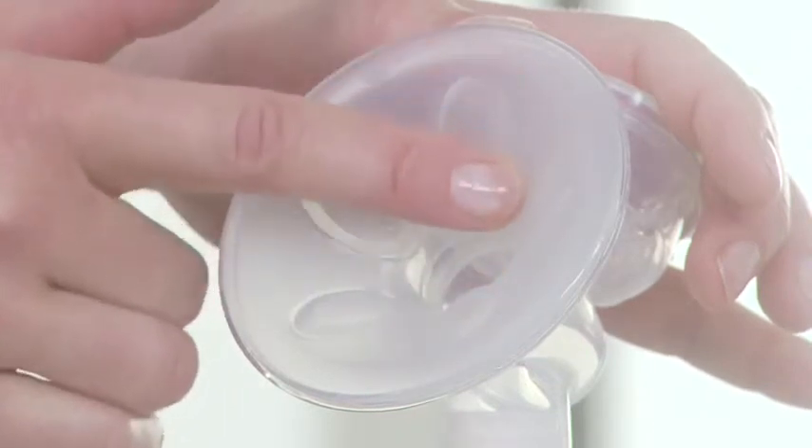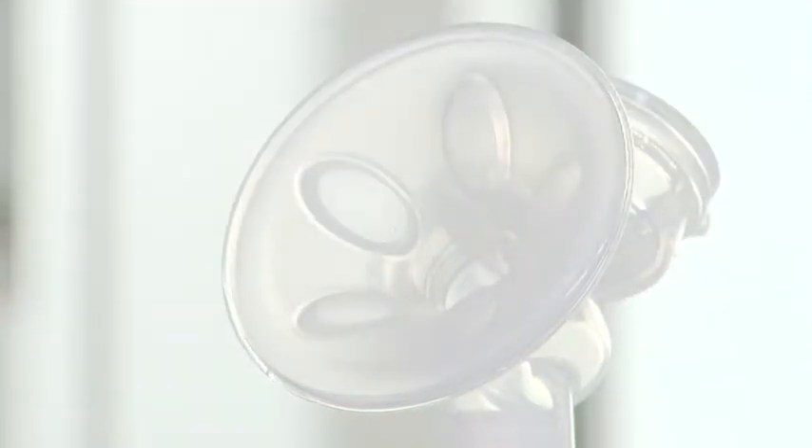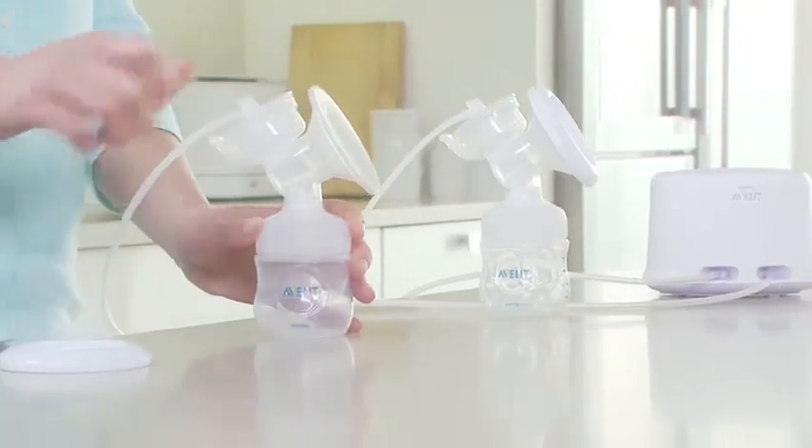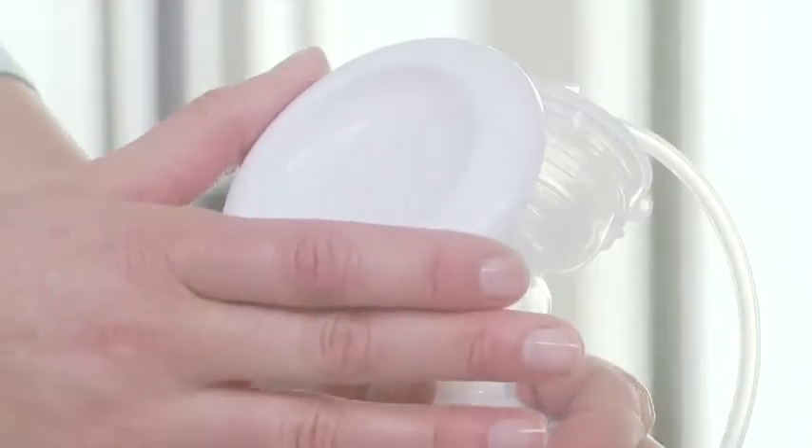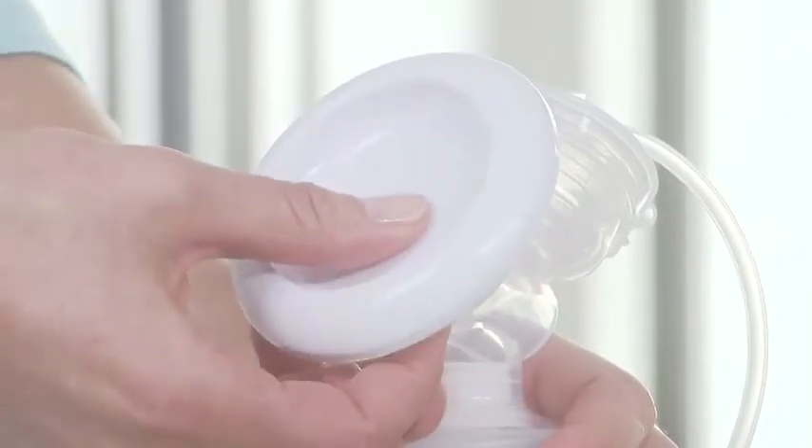For the twin electric breast pump, just repeat the same steps for the second pump body. You can place the cover over the massage cushions to keep the breast pump clean while you prepare for expressing or when travelling.